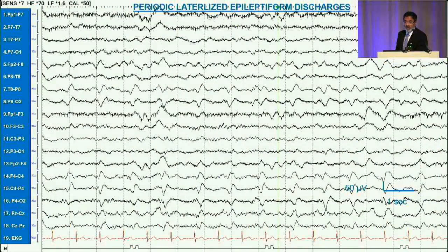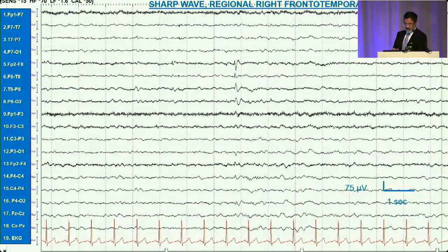So such as a stroke, viral encephalitis. It's commonly seen in patients who have very intractable epilepsies, maybe in a patient who's just recovered from status epilepticus, where you have a periodic pattern that remains in that left, in this situation, the right temporal chain, and often refractory to medications. So something important to recognize, and it impacts treatment and surveillance.